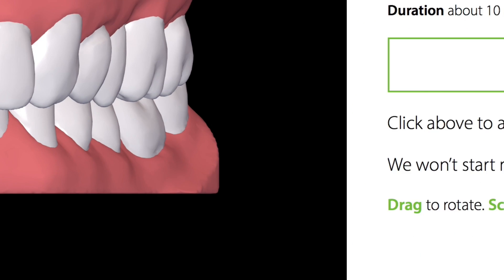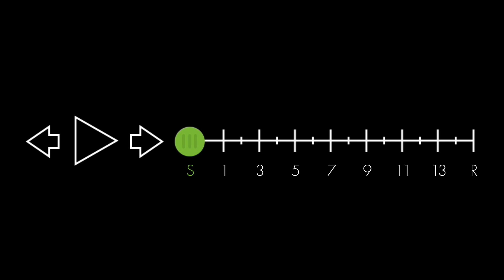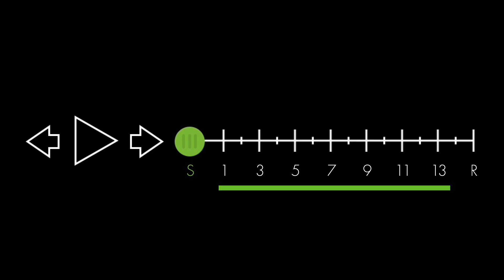At the bottom left of the setup, you'll see a timeline representing every step of the case. The starting position of the teeth is shown at the left. Steps with checkup appointments are numbered on the timeline, and the final position of the teeth is represented on the right as a retainer.